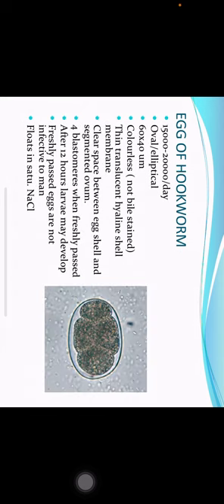Egg of hookworm: hookworm lays about 15,000 to 20,000 eggs per day. The eggs are oval or elliptical in shape, 60 by 40 micrometers in dimension. They are not bile stained. They have a thin translucent hyaline shell membrane. There is a clear space between the egg shell and the segmented ovum.